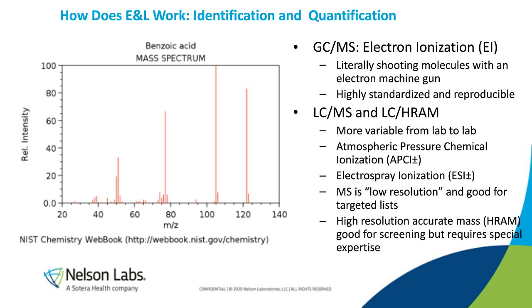If you want to do the opposite, like a reverse lookup, then that's something that you can't do for free. The first line approach to make these IDs is that these mass spectra and retention times are collected, and then that information is compared in a reverse lookup fashion to huge public databases and also to private databases. For GCMS, this works really well with public databases. I'll explain where there's some weaknesses in just a second.